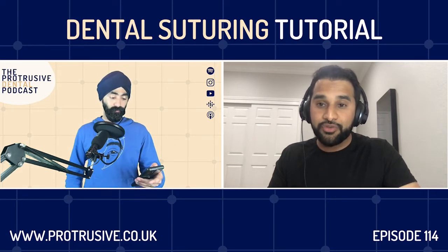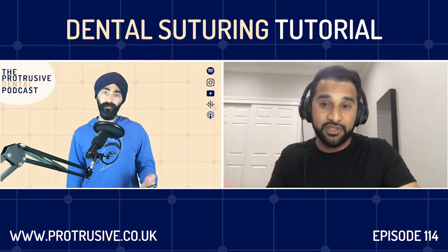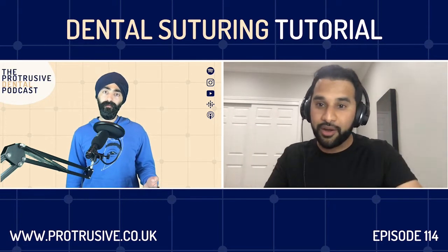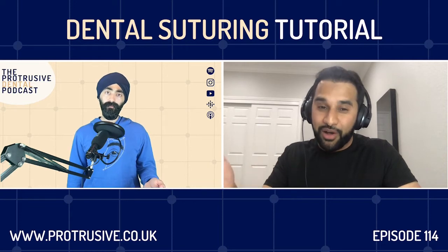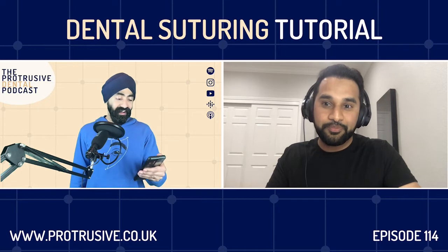It's a great suture for extractions. I'm not a big fan of the gut sutures for extractions, especially sometimes in wisdom teeth, especially if there's muscle pull, it just breaks them apart. So the Vicryl can actually have some strength and fall out if the patient doesn't come back for a follow-up. Yes, I can vouch for that one.